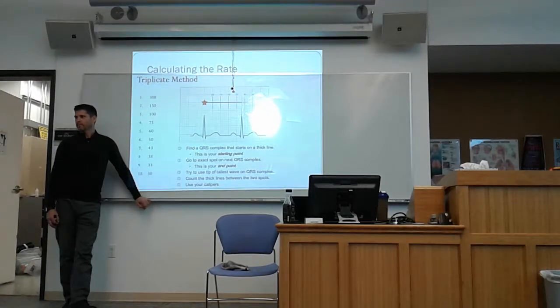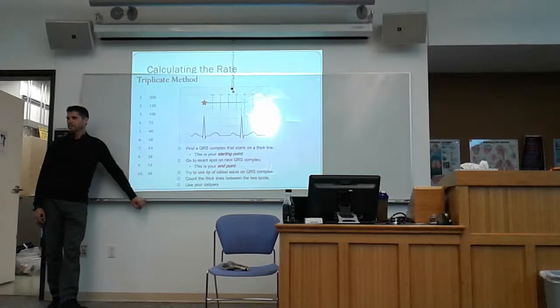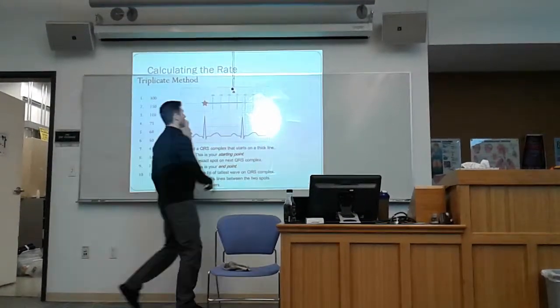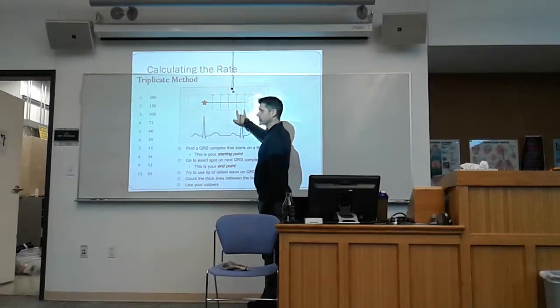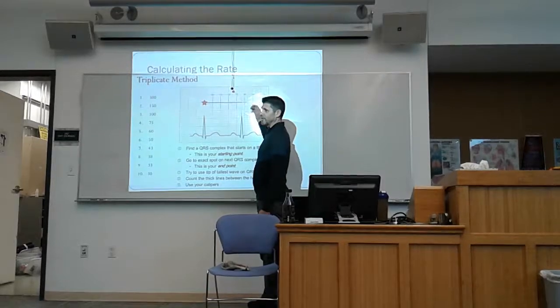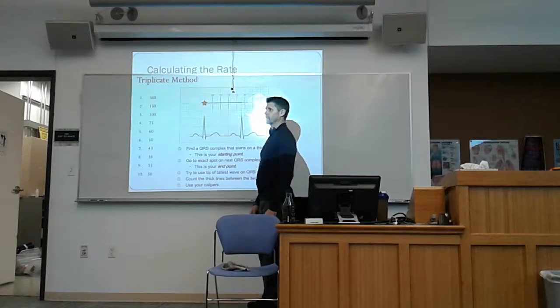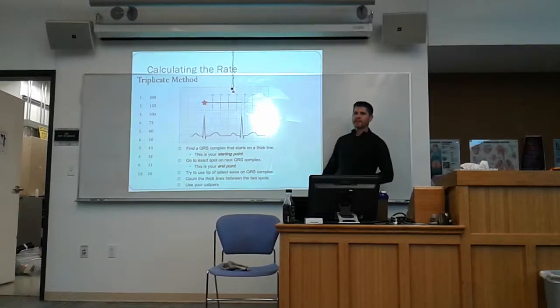When we're in the field and we know this method, can we say, oh, it's somewhere between 60 and 75, it looks about 67? Or should we do that? Yes, that's perfectly okay because you'll be within a pretty close range, right? You know that there's a 15 beats per minute change there. You're less than halfway, so you're less than 7 off, right? So 66, great. And it was awful darn close. I know, it's perfectly okay. Make sense on establishing rate?